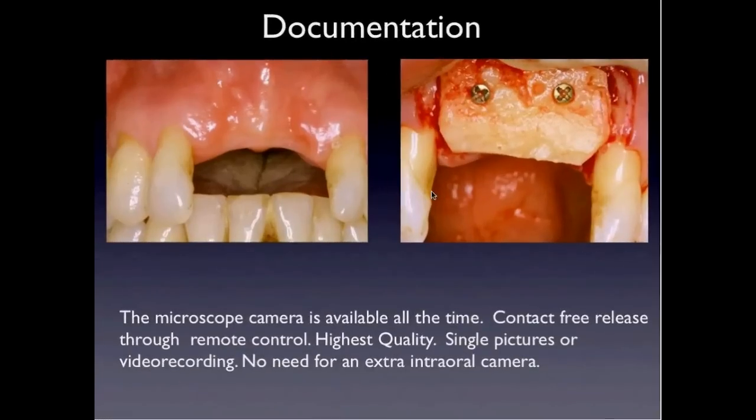Now, I said already that documentation is getting more and more important, and first of all, you have to document the beginning of the work, the situation before you started treatment, because that's a picture you never get back again. If you forget the last one, it's not so important. You can always do that again. And with a microscope, the camera is there all the time. You can make contact-free pictures without shaking. You will get the highest quality.